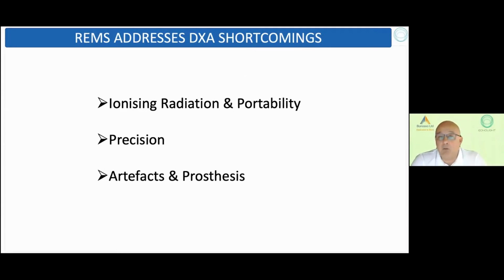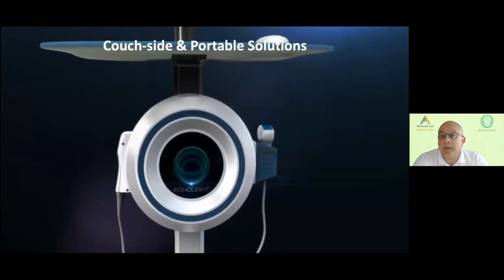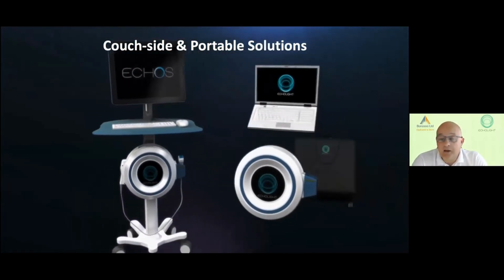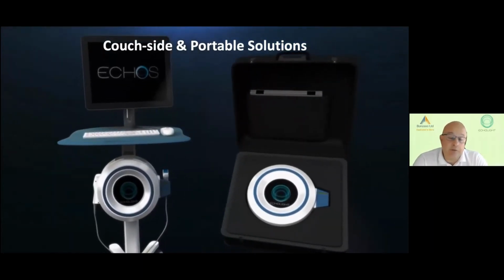of what DEXA is. I mean, it requires a special isolated room because it uses ionizing radiation, and it has to be fixed within that room. It cannot be moved out. Whereas you have something that is completely portable and transportable, and much easier, being ultrasound, and because of its ultrasound, it is by default much easier to decontaminate than a DEXA table and a DEXA room.